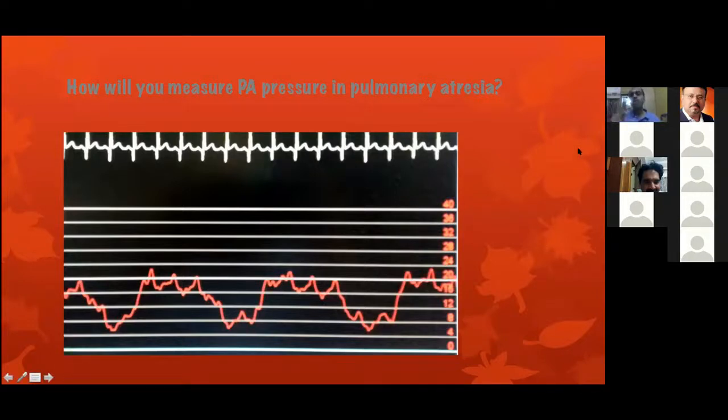The moment you go into those levels, obviously you are going out of true physiology. Ideal hemodynamics are recorded on reasonable conscious sedation and in awake state rather than in these unphysiological environments.